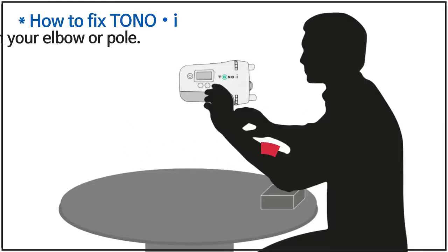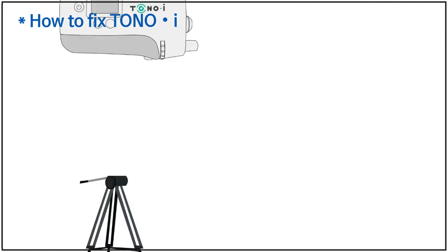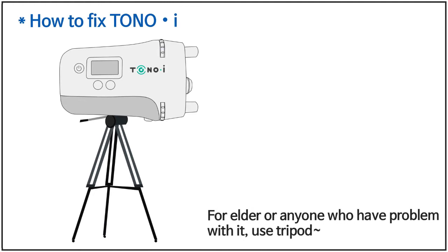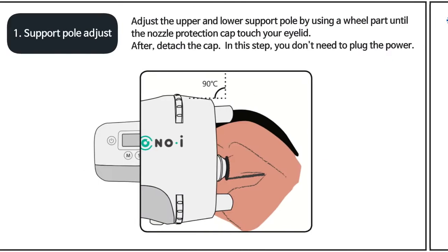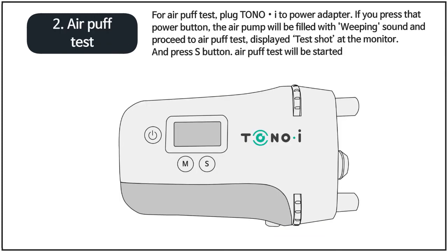How to fix TonoEye: fix it on a table with your elbow or pole. For elders or anyone who has problems with that, use a tripod. First, support pole adjust — adjust the upper and lower support pole using a wheel until the nozzle protection cap touches your eyelid. After that, detach the cap. In this step, you don't need to plug in the power.